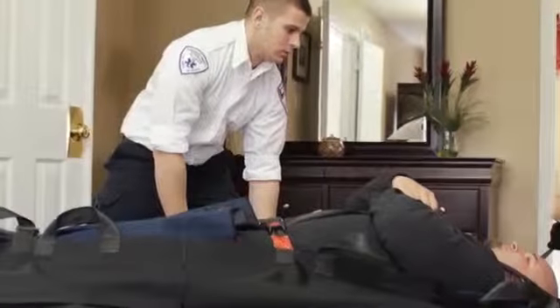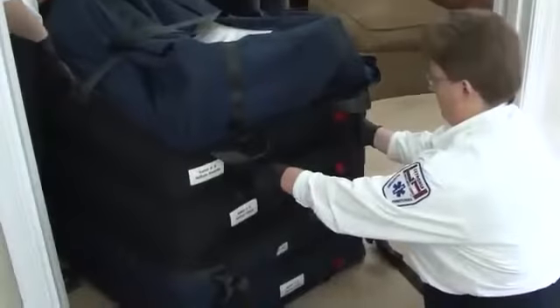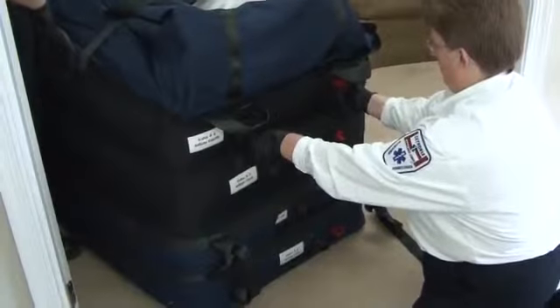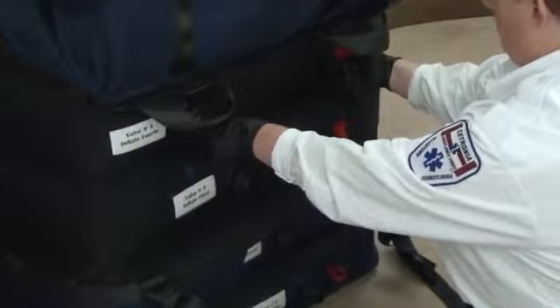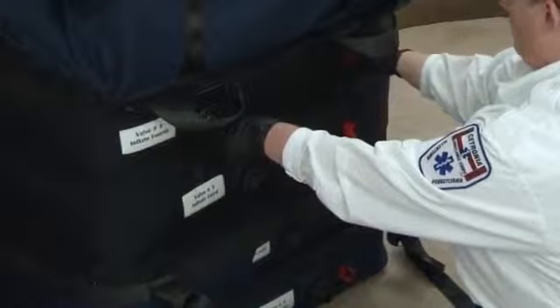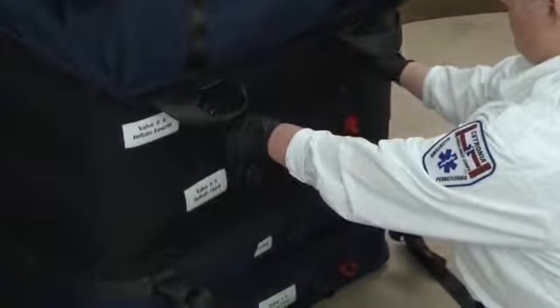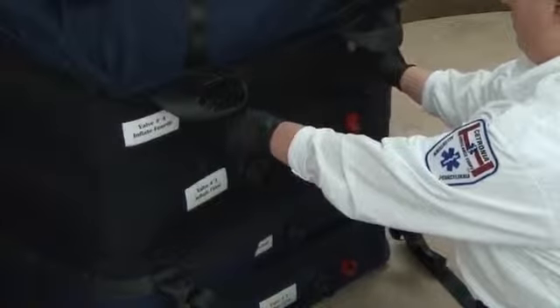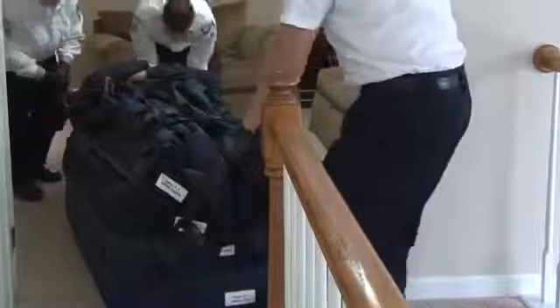Inform the patient that the top chambers will be deflated and explain what they will hear and feel. Begin bleeding out the air by depressing the black one-way valve labeled valve number 4 to reduce the pressure, then fully release the air by opening the uppermost red deflate valve on chamber number 4. When chamber number 4 is fully deflated, repeat the process for chamber number 3. Do not release both chambers at once. When both chambers are fully deflated, retighten the straps and move into the stairwell.